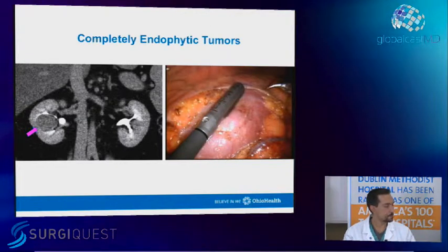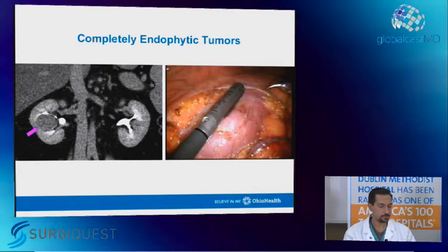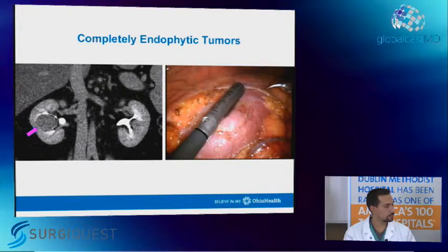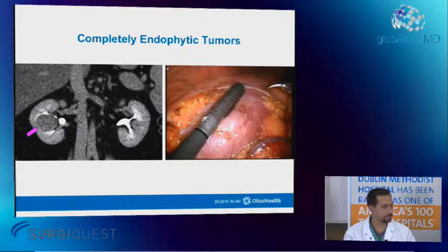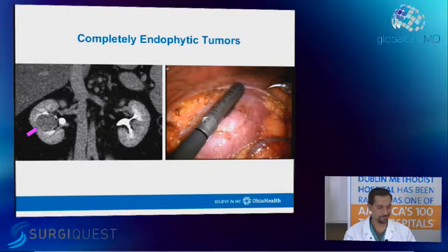Yeah. So, I really rely on the intraoperative ultrasound during the case. Obviously, you have to have it. It's not that you need it for every case, but in these cases you not only need it, you need to know how to use it, and that's the biggest issue, because you've got to be good at it. You don't want to become good at it on these cases. You want to become good at it on those easy cases.